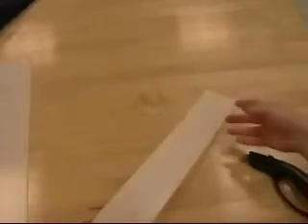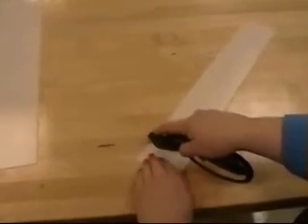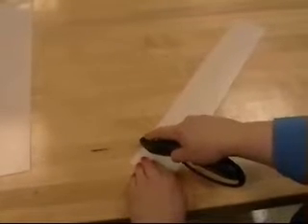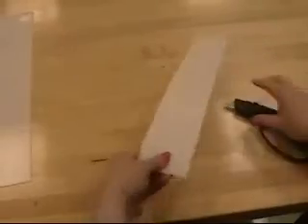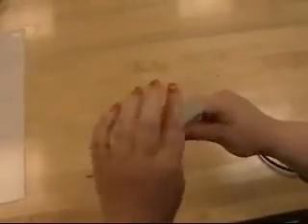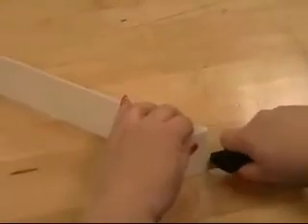Next, I want to cut the piece of the appropriate width, which would be about half the circumference of the finger. So I'm going to cut this somewhere between 2–2.5 inches wide, depending on the person's finger, in the same manner where I score the material and then fold it and then cut along the score line.